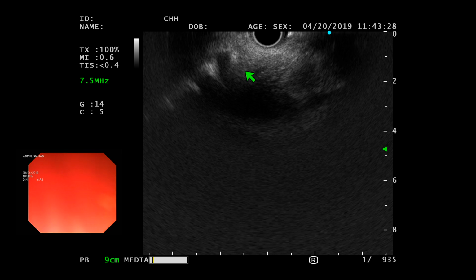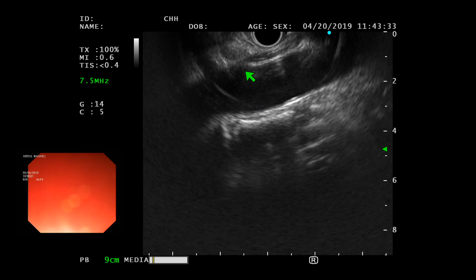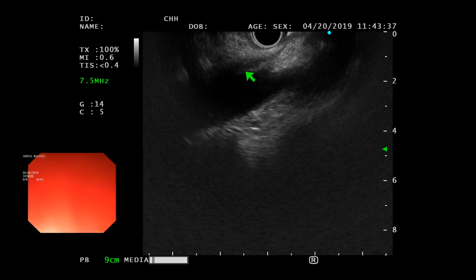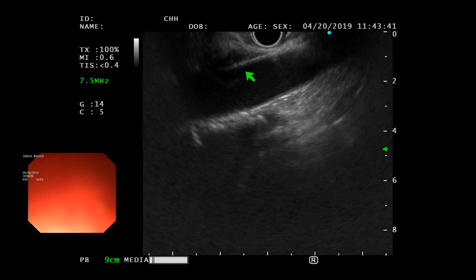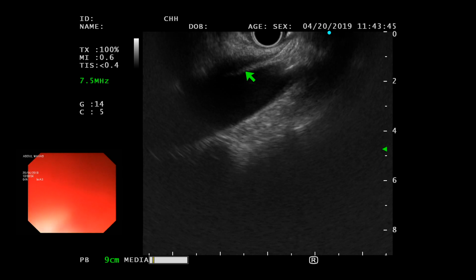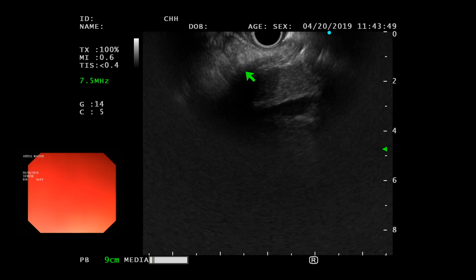Obviously if it was malignancy, then... So you can see that Dr. Saab has actually done everything. I've actually not done anything, except for slight touching of the distal end of the scope. So he's achieved really all the objectives that we had set off. So now I think I can take the scope. Yes, sure. Thank you.